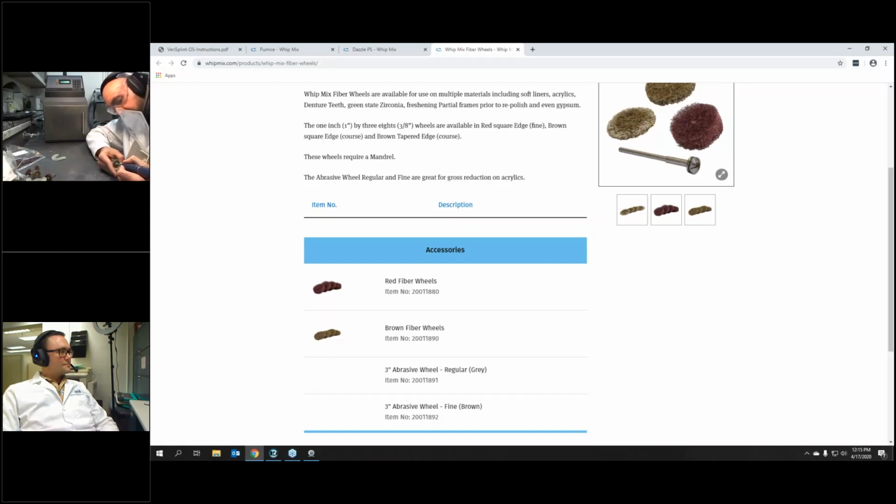And you can see maybe a little bit of the dust flying. Now I do have vacuum going. You can wear a mask during this point in time, and realistically, we all should probably be wearing masks right now. Let's see, while you're working on that, I'm going to address a few more questions.